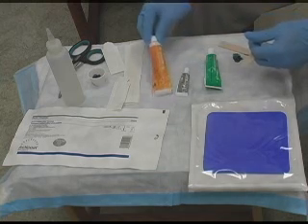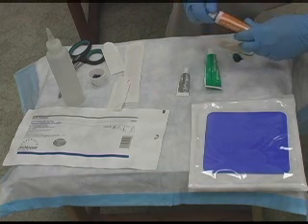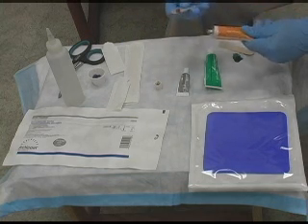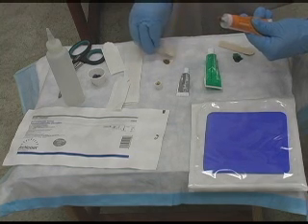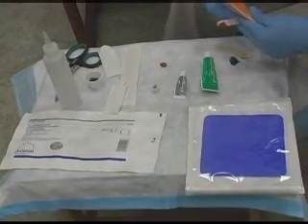Another product that we use here is called Iodazorb. Iodazorb is a cadexomer iodine. It is an iodine-based dressing, but the iodine does not release unless there's infection going on in the wound. This one here you can use on any type of wound. It will debride it, but at the same time it absorbs drainage. So if you have a wound that's draining a lot, this is perfect for it.